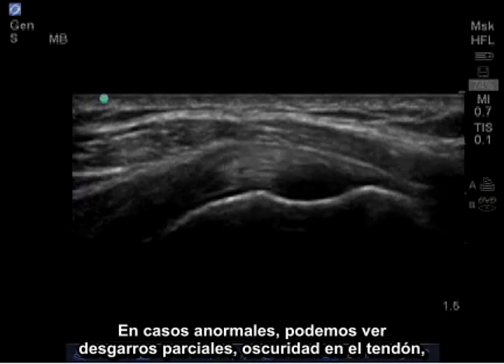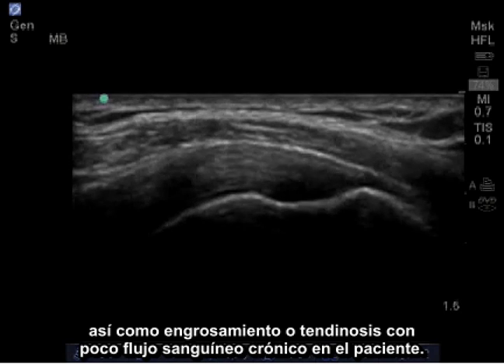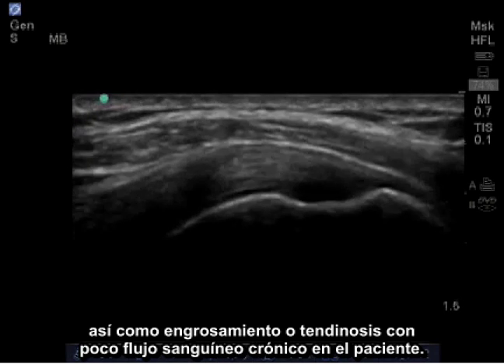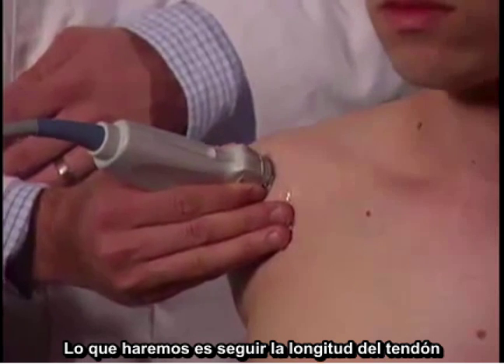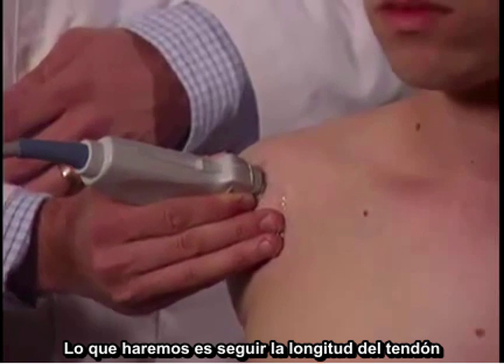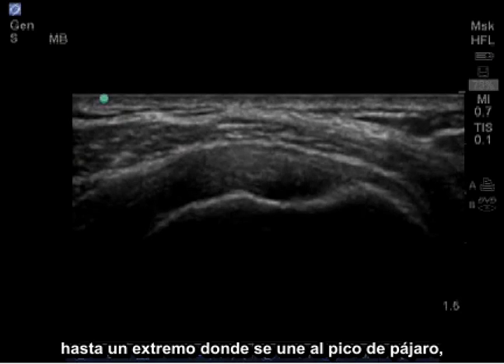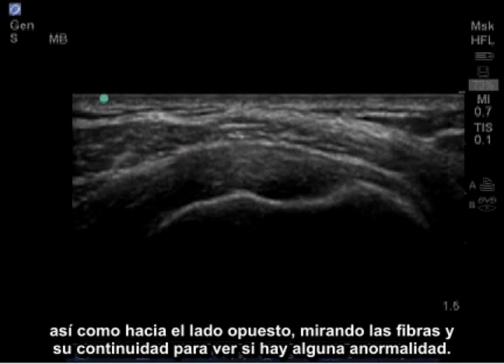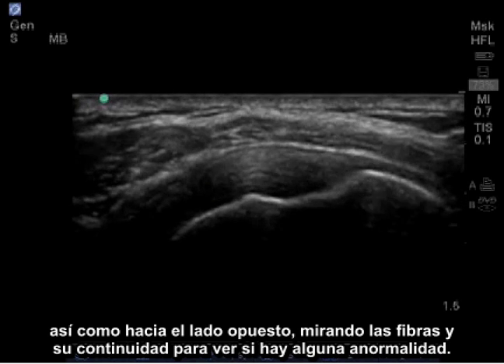In abnormal cases, we may see partial tearing, blackness within the tendon, as well as thickening or tendinosis with chronic poor blood flow. What we're going to do is follow the length of the tendon on one end where it attaches at the bird beak, as well as through the opposite end, looking at the fibers and continuity to see if there's any abnormalities.